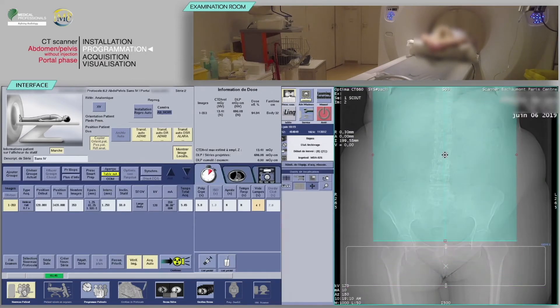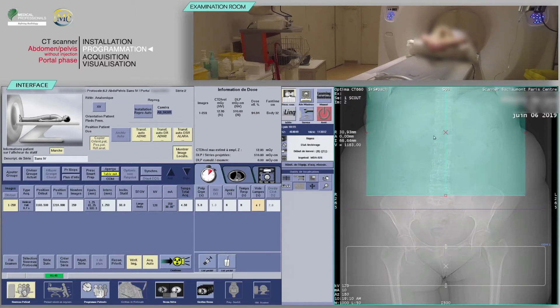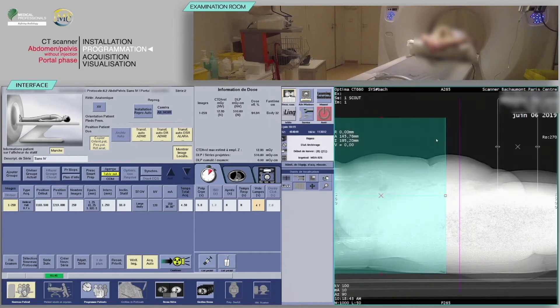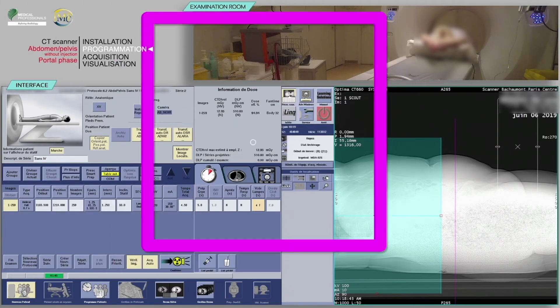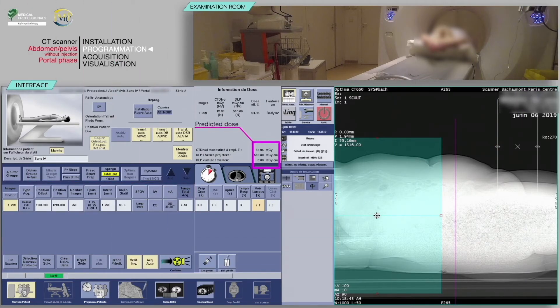For the first acquisition of the abdomen without injection, position your slices box to cover the entire abdomen from above the diaphragm to the iliac crest on the AP scout view. On the lateral scout view, place the slices box at the mid-thickness of the patient. Verify the consistency of acquisition parameters, which are often pre-configured. Before continuing, check that the predicted dose is consistent with the diagnostic guideline values.